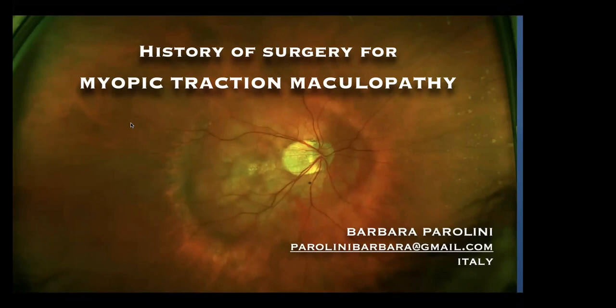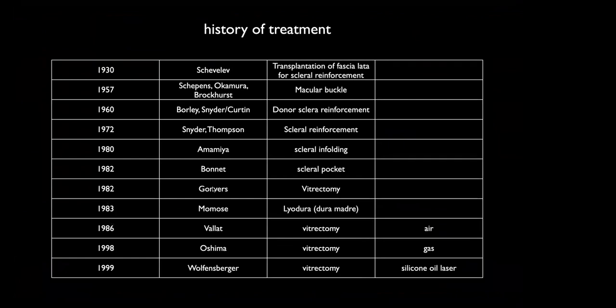So let's go into the surgical part. I want to show you what happened in the past. Myopic traction maculopathy was originally treated from the external side. It started in 1930, basically one century ago, with implant of fascia lata behind the macula. Then the first attempt of macular buckle in the 50s, and then all different sorts of episcleral surgery. And of course, in the 1980s, vitrectomy starts.